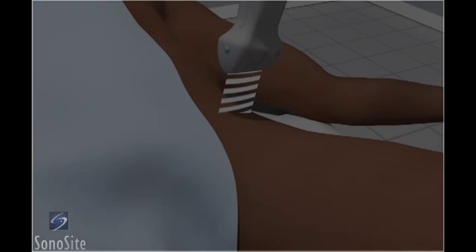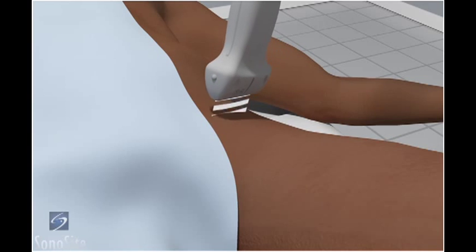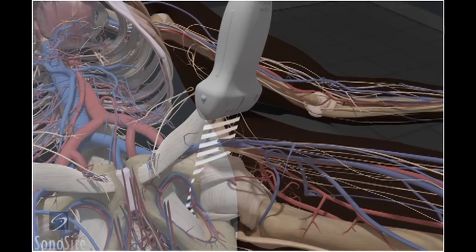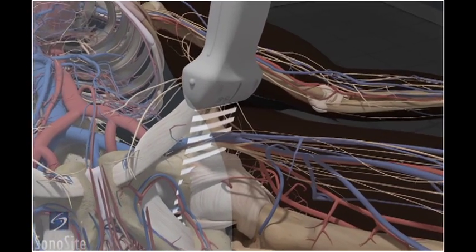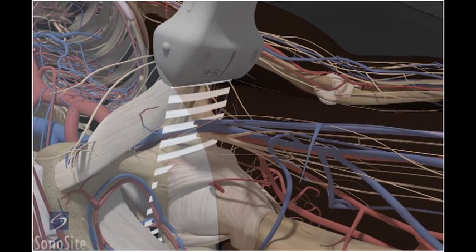The patient is in a supine position with the leg in slight external rotation and flexion. Place the transducer in a transverse position with the orientation marker to the patient's right side at the level of the inguinal ligament.